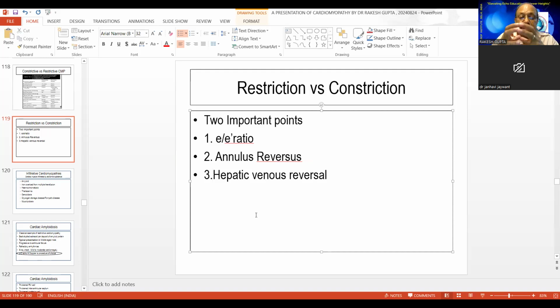Why? Constriction means around the heart there is a constriction, a thick shell of calcium, 99%. So the septum can still relax, but in constriction there is a stoppage for the lateral annulus because it cannot relax properly.